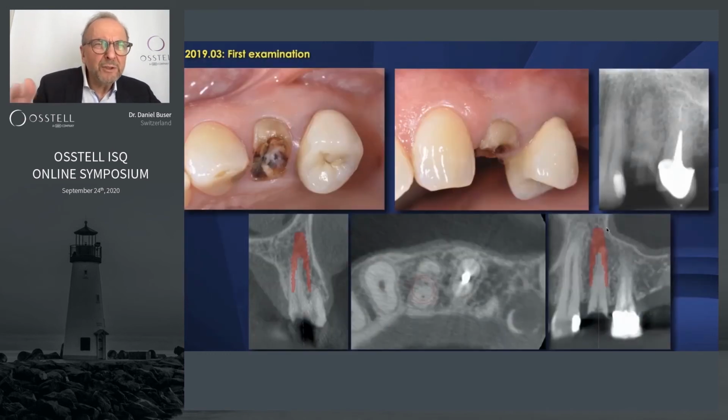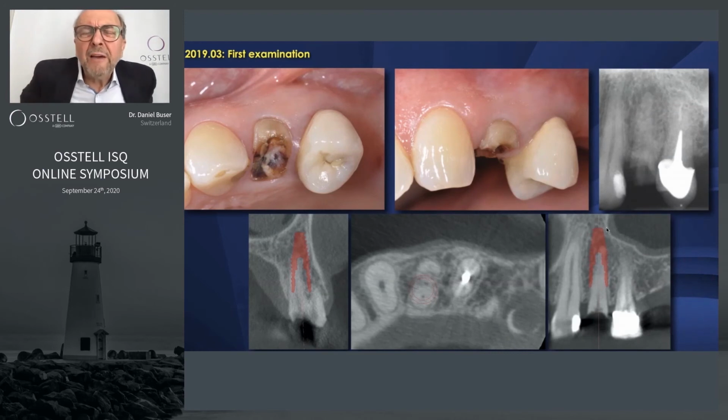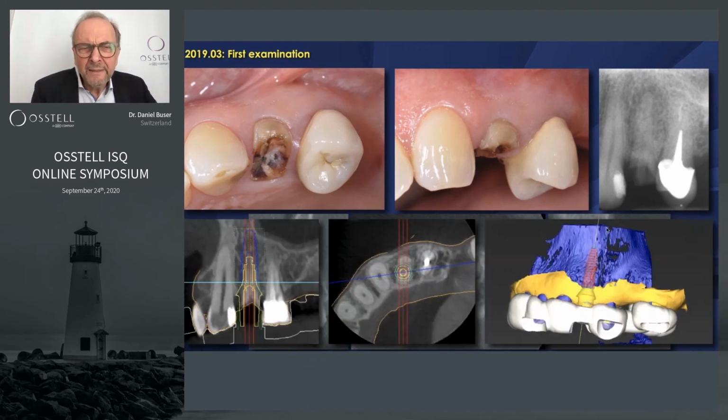Then a more recent patient we did in 2019. We have further improved the technology. Now we actually produced already the provisional crown with CADCAM technology. You see very favorable anatomy. The facial wall is thick. Now we are using the so-called BLT implant of Straumann because this further optimizes the primary stability of the implant. The planning is done. Then the matching is done, the position is selected. It's always a compromise between the prosthetic needs and the anatomic needs.